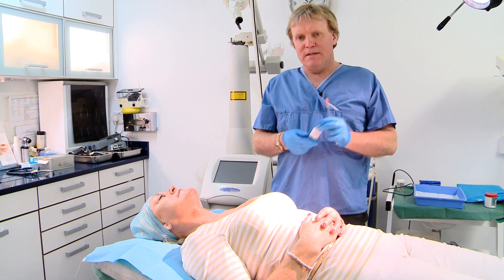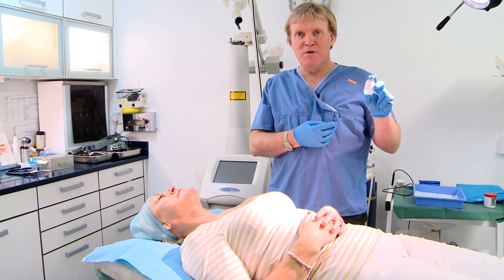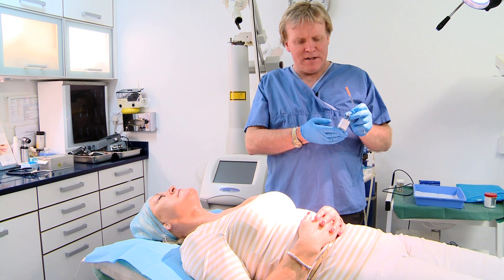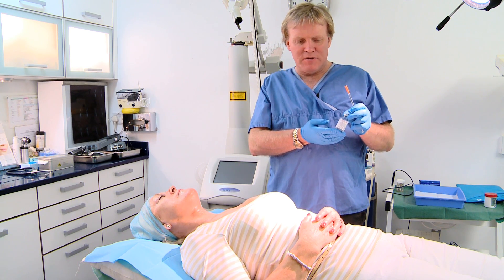For the regional anesthesia, what we tend to use is xylocaine or lidocaine 2% with adrenaline. You can get this in Ireland; you cannot get it in Britain, but I think you can get it in the United States as well.